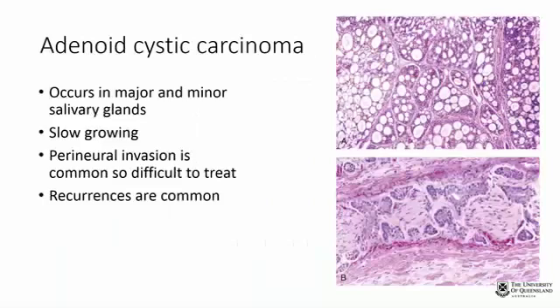The last salivary gland tumour I will talk about is the adenoid cystic carcinoma. These are slow-growing tumours that often occur in the minor salivary glands. They are composed of small cells arranged into tubular or cribriform patterns interspersed with hyaline material. Although slow-growing, these lesions have a tendency to extensively infiltrate nerves, causing recurrent disease over many years.